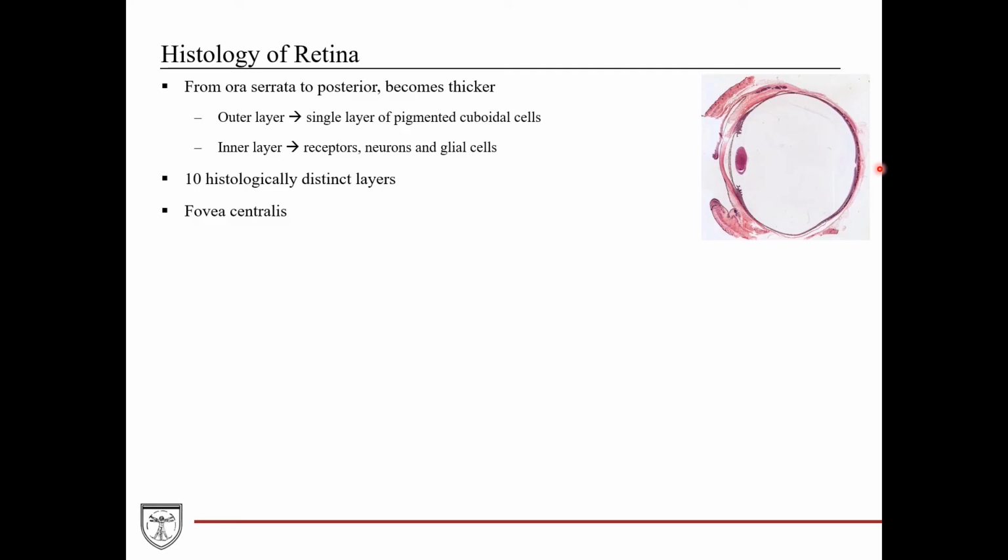So whatever of the world we want to see at the highest resolution, we would focus that image right onto the fovea centralis. Here, the 10 layers of the retina are attenuated to allow for the photon to excite the receptors without too much interference. This is also the area of the highest concentration of cones. There are essentially no rods in this area, to allow for the greatest acuity of color vision, if you will.